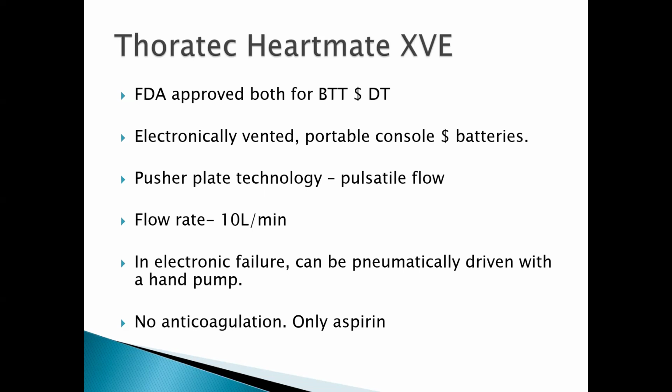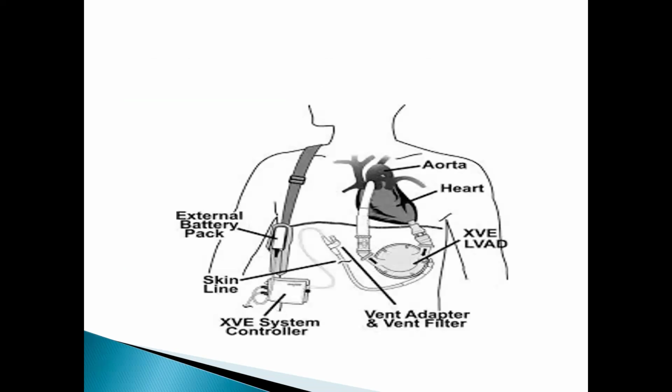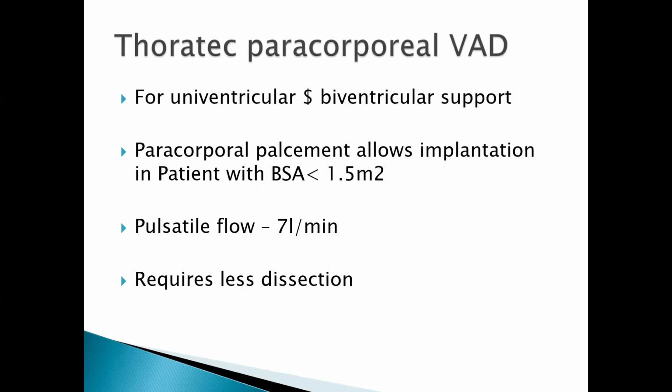One thing is that it does not require anticoagulation. For a patient using this Thoratec HeartMate, you may not necessarily bother about placing the patient on an anticoagulant, as aspirin alone can help. And this is what the Thoratec HeartMate XVE looks like. Next slide, please.